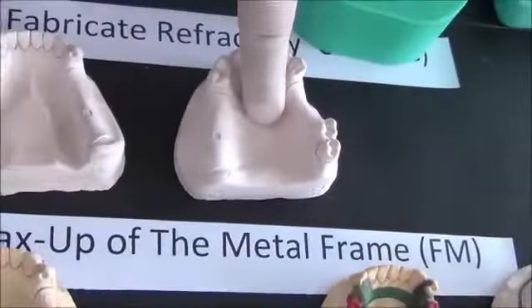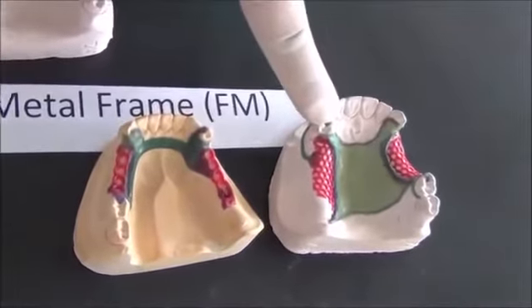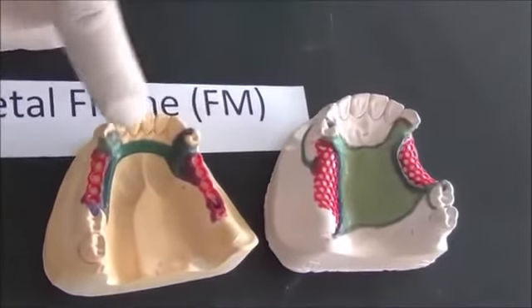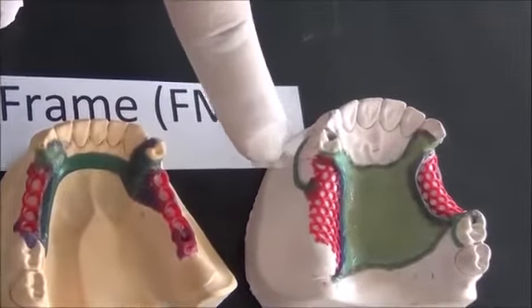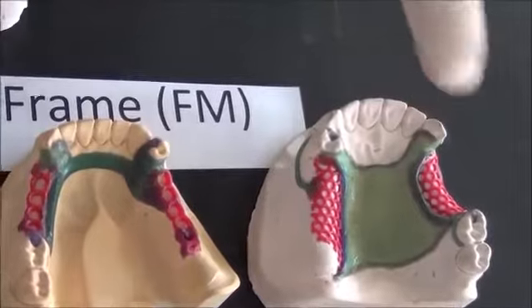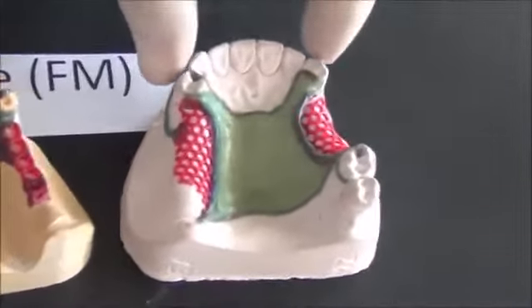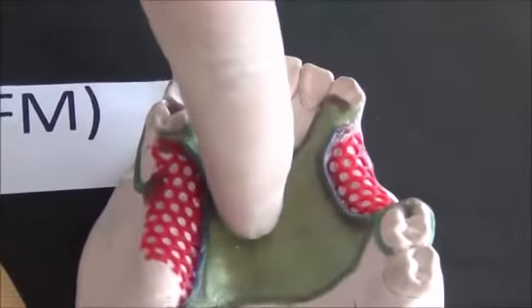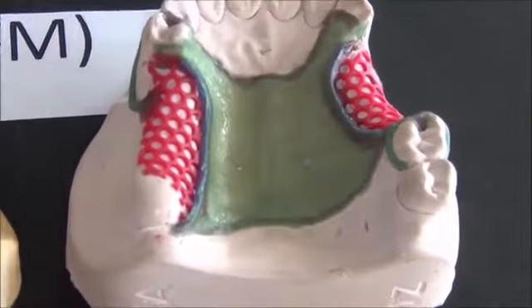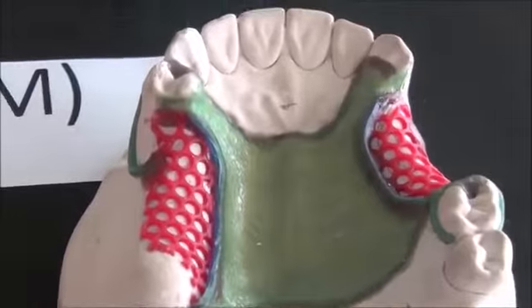After finishing constructing the refractory cast, they are ready for the step we call wax up. The wax up is done using wax patterns. These wax patterns come ready, and they are in the same shape that we want our final metal framework to have. As you could see, they come in colors, they have different shapes, but they have specific measurements that I need to incorporate in my metal framework.